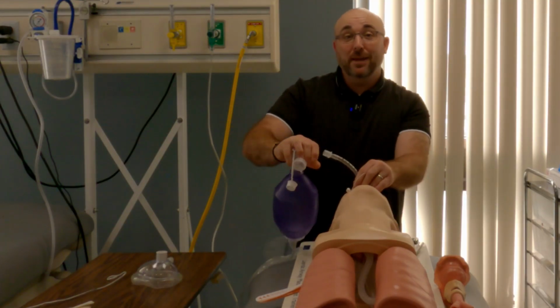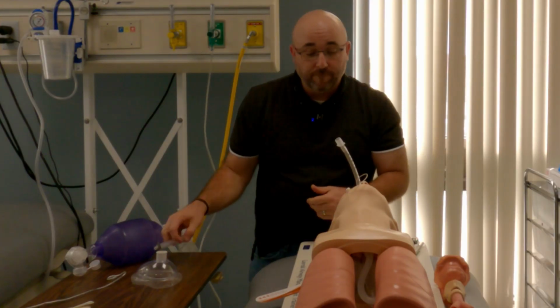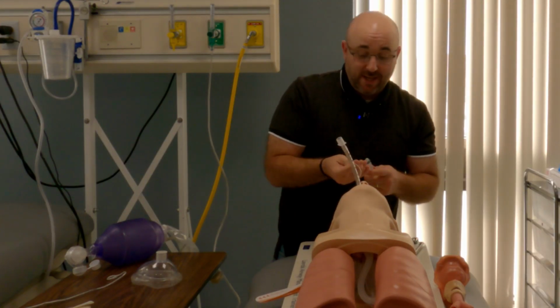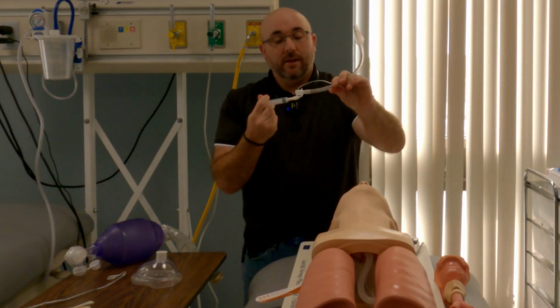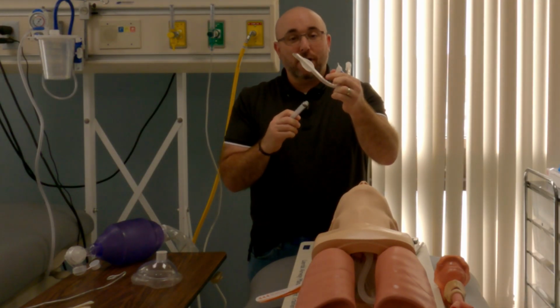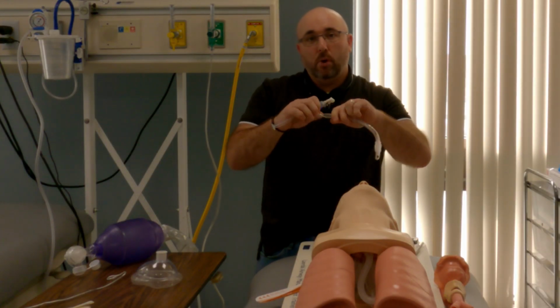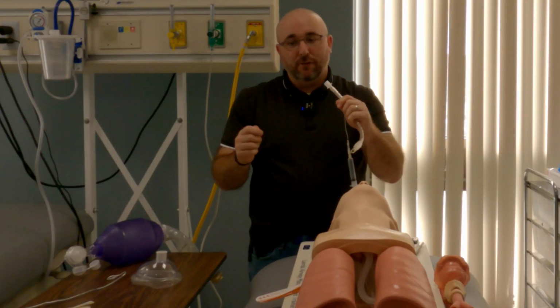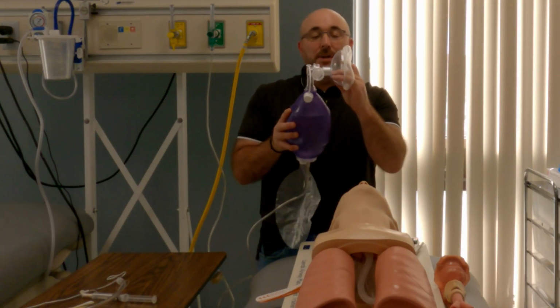And those are the 5 pieces that you're going to need. What I would recommend, if you've never helped with this before, is that you stick a stylet inside of an endotracheal tube. You get the feel for inserting this air and pulling this off. That's really important. So putting air in and pulling it off, pulling that stylet out to get the feel for that.